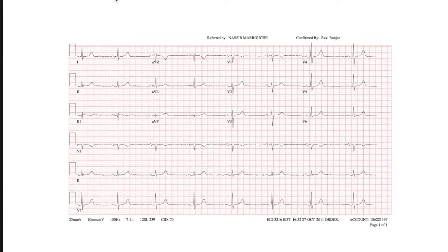Since you already did P waves, Tanner, you can do P waves. Okay, I'll switch lead here. Sorry, I'm on lead 2 on the bottom. The bottom says 2. That bottom thing's called the rhythm strip. Great. Ben, will you do a QRS? Okay, so we have some QRSs, and then Derek, will you do some T waves?